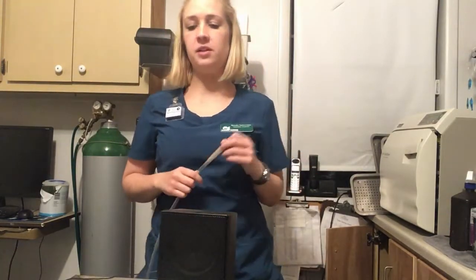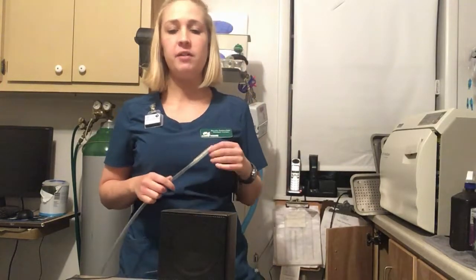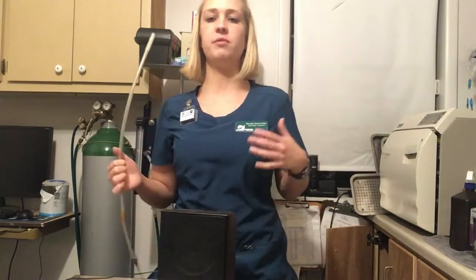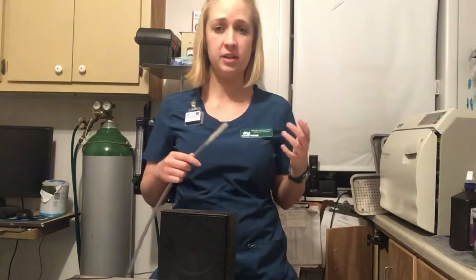This is great because it can be kind of a backup to the pulse oximeter, and give you a more accurate representation of the heartbeat, and make sure that you can hear those respirations. It's really mostly a backup and a support, just to make sure you're getting the correct information.